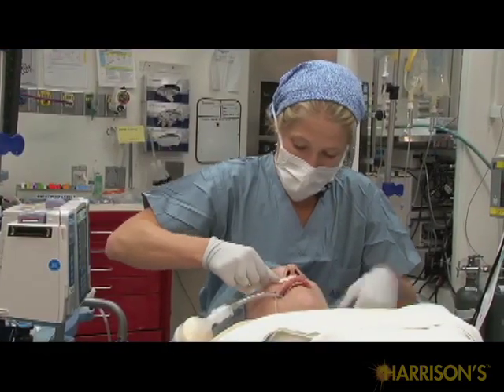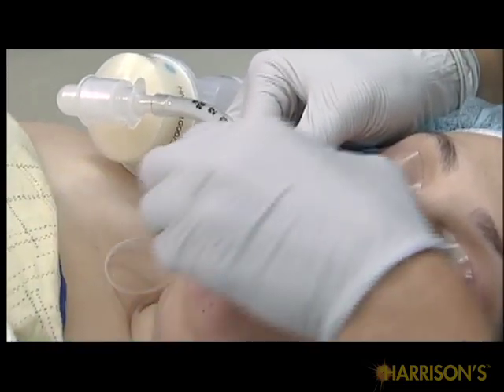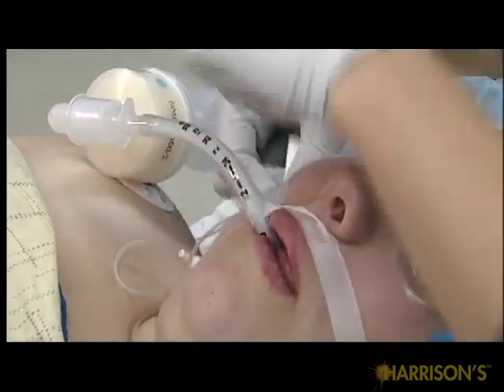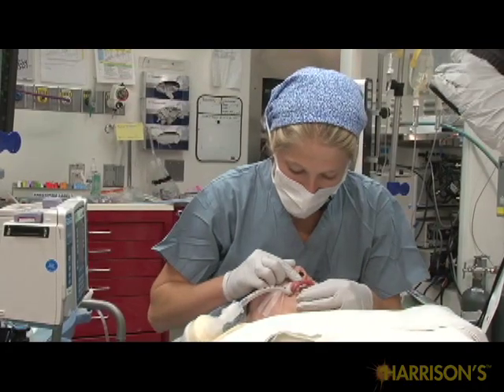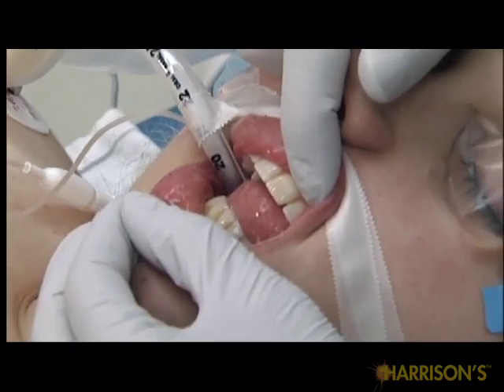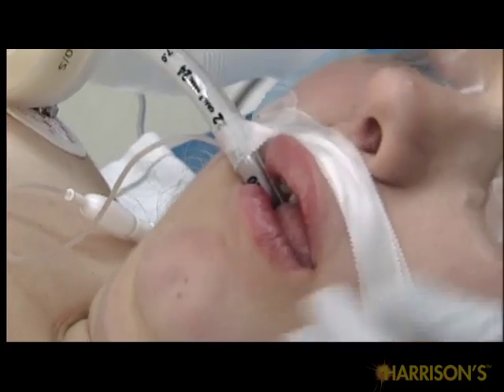After successful endotracheal intubation, it is important to use tape or a tube tie to secure the airway. You should note the depth of the endotracheal tube at the teeth when breath sounds are heard bilaterally. Therefore, if the tube gets pushed into or pulled out of the trachea, you will be aware and can re-secure the tube at the correct depth. It is also important to adequately sedate a patient once intubated to ensure patient comfort and that the endotracheal tube does not become dislodged.